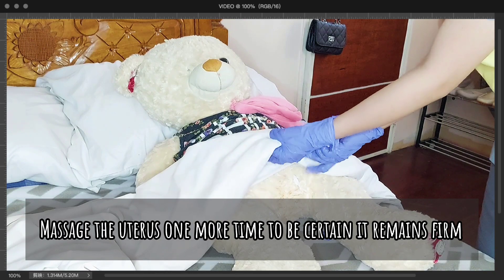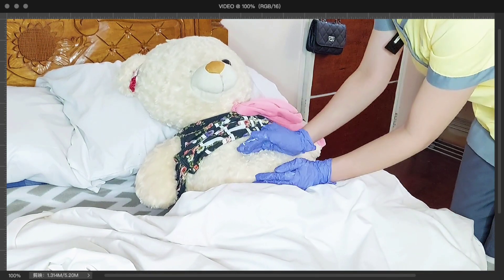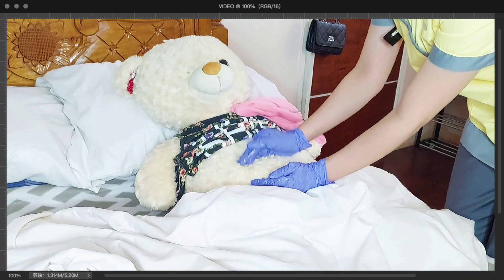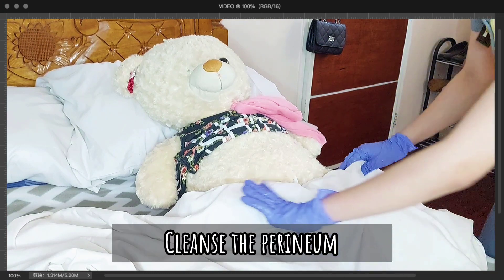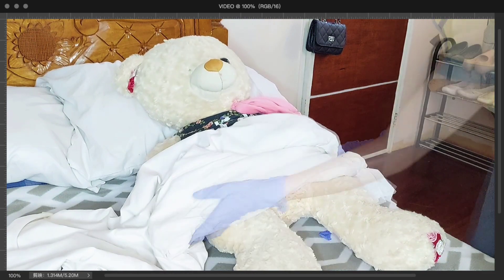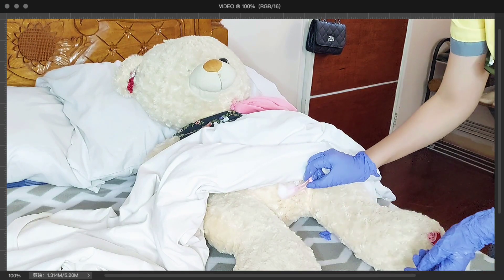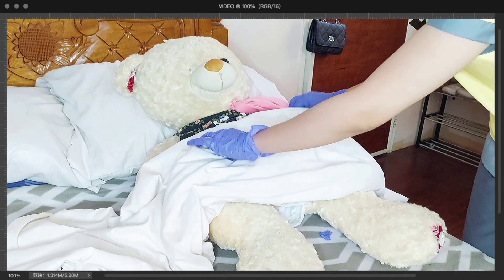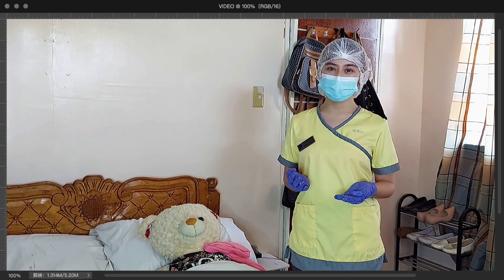Ma'am Max Payne, we are almost done. I will do a fundal massage one more time just to make sure that your uterus is firm. I am now done with the procedure. I will now clean your perineal area and apply a clean perineal pad. This will help with patient comfort, hygiene, and to prevent infection.